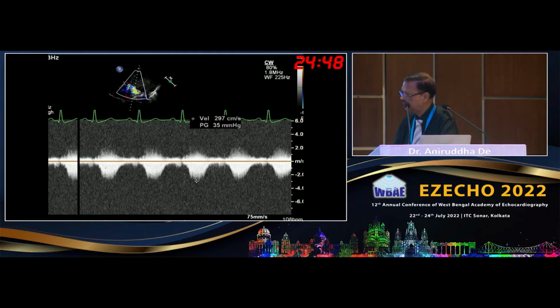So I think contrast can definitely help you. If the contrast lights up this mass, then you are very worried, because that is probably malignant, except for a primary hemangioma, which would not have the variegated appearance. So this can be teratoma, thymoma, anything. But vascularity will be the first thing that the echo can tell us.